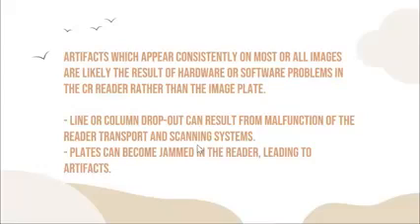Okay? Artifacts which appear consistently on most or all images are likely the result of hardware or software problems in the CR reader rather than the imaging plate. So kanang mga magbalik-balik na artifacts, maski naka-10 na ka na exposure, balik-balik lang yapon ang artifacts, that means that it is most likely ang iyang cause ana is naa sa hardware, okay, or software, not sa inyong imaging plate. Okay, most likely.